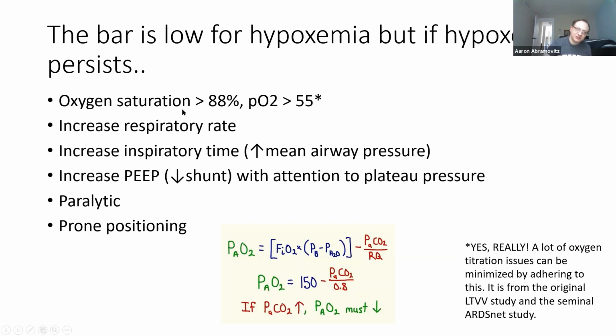So what I'm teaching you here is the book answer. It may not be what you experience. It is what I practice. And it's from the original low tidal volume ventilation study and then the ARDSnet study. And this has been verified on further studies over time. Cochrane Review has shown with low tidal volume ventilation, this is an okay oxygenation goal.